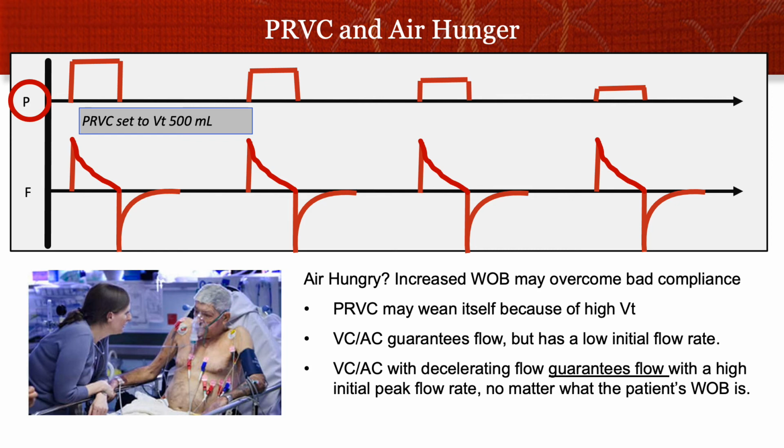So I went up to the patient, and I looked at him, and he was working incredibly hard to breathe. Could see all his ribs sucking in with every breath, his belly moving out, tracheal tugging, and he was crying and covered in sweat. Looking at him, you knew exactly why. His troponin was going up. And when I took a look at the vent, I saw that the vent was in PRVC mode, and the vent was delivering no pressure for the breath. The vent had weaned itself to PEEP. Let's see how that might happen.